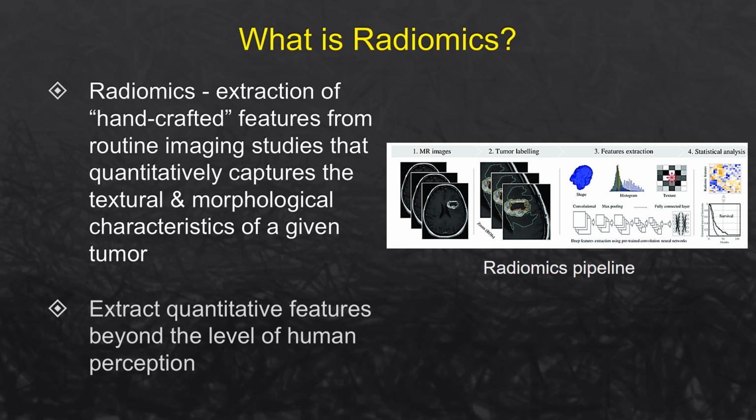So here you have a set of imaging studies with MRI plus contrast. Here's the tumor. You segment the tumor and the surrounding areas of abnormality and create these regions of interest or ROIs. And then if you extract some features from those, which we will talk about, like the shape, the histogram, textures, etc., and then you analyze these features using deep feature extraction, and you can use pre-trained convolutional neural networks, for example, and then correlate them with genetic expression or the survival, etc.